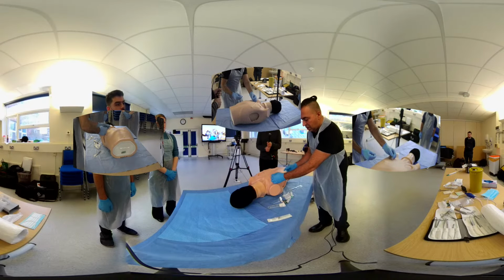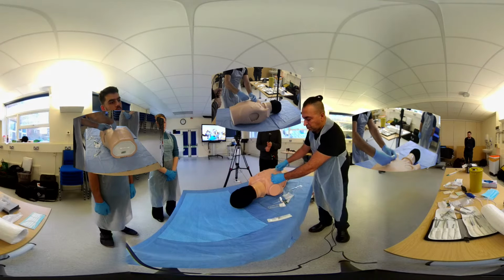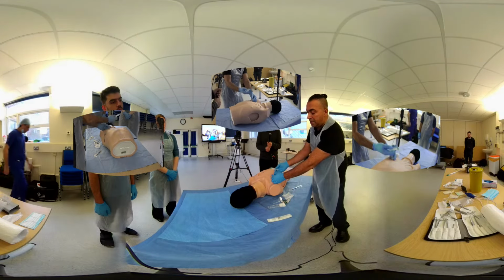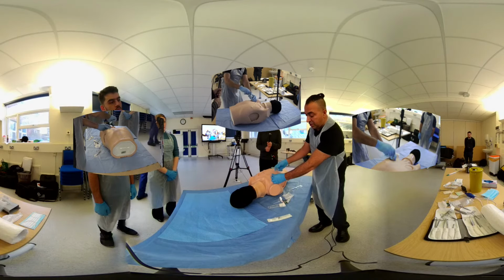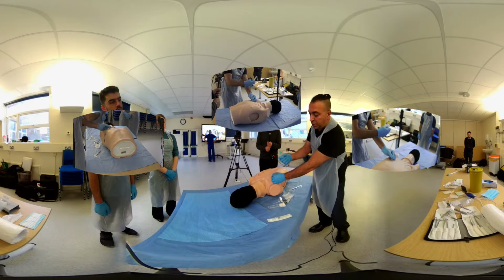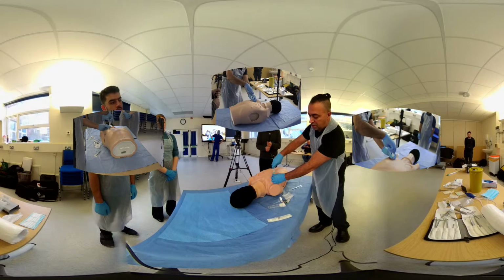So you're taking out the sharp, and you may automatically at this stage have a hiss, maybe have blood splashing out, but you can also, either with fluid inside this, with some saline inside, or with an empty syringe, aspirate, and that's actually showing that you've got the correct diagnosis.